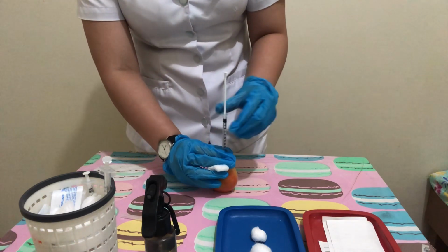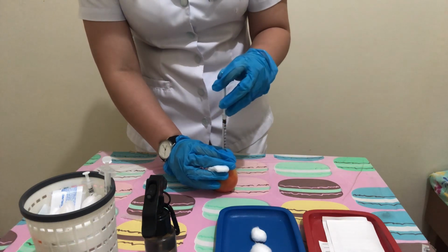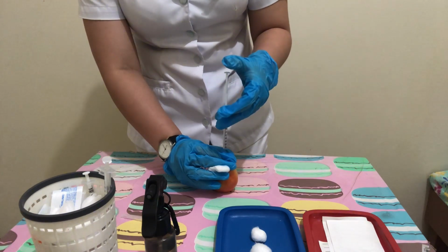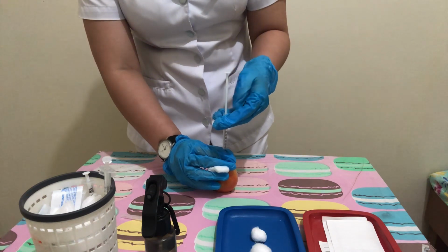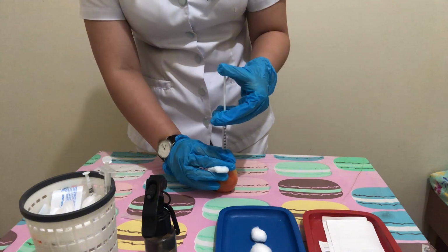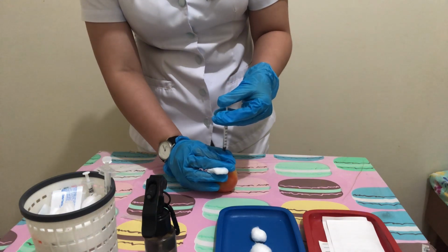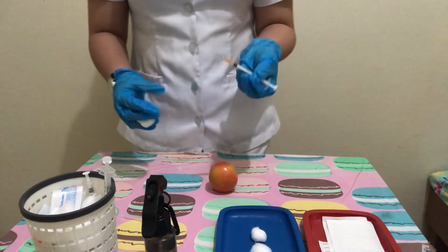So you want to steady the syringe by holding it with your thumb and forefinger. Now aspirate by pulling back the plunger with your dominant hand to determine if you have hit a blood vessel. So if blood appears, it means that you have hit a blood vessel, and then remove and discard the needle and syringe and start over. If blood does not appear, inject the medication steadily and slowly. Then smoothly withdraw the needle at the same angle you inserted it.